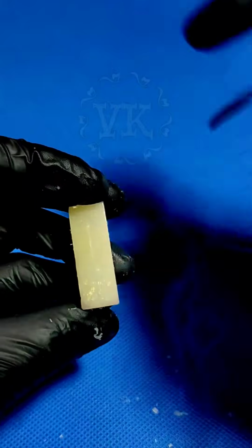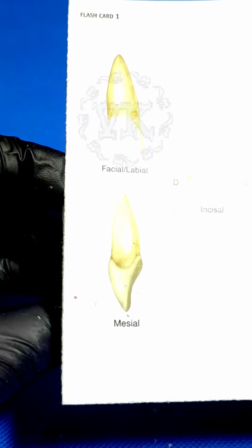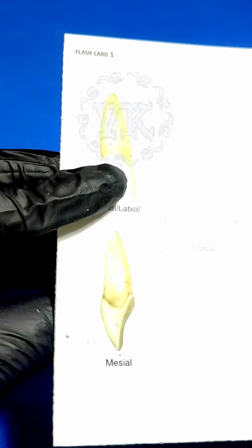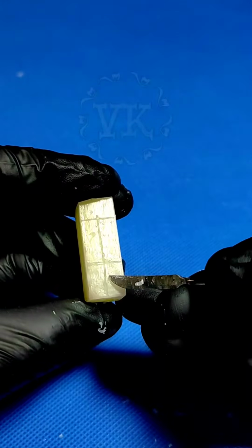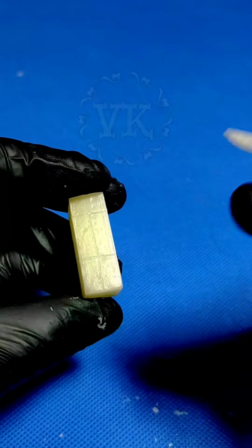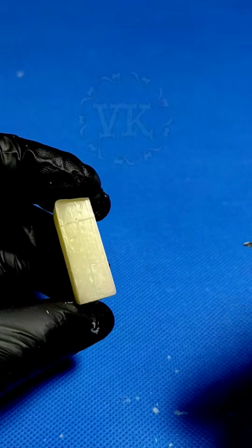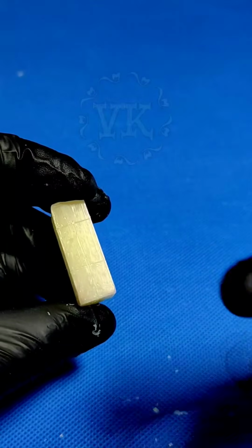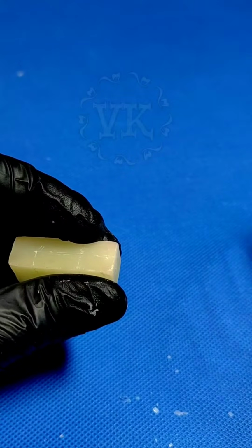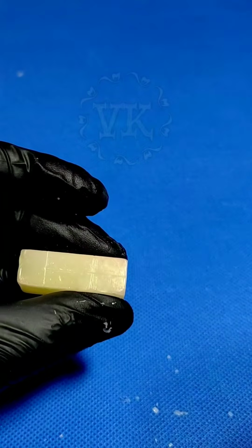And then as we discussed, I'm going to draw this view. The maximum thickness from this point to this point is 7 millimeters. So when I bisect 7 millimeters, it will be 3.5 on this side and 3.5 on this side. 3.5 is something difficult to measure from the ruler on the wax block, so we would take 4 millimeters and 4 millimeters. So effectively it becomes 8 millimeters. This is also in accordance with the previous technique, so all the measurements are taken half a millimeter to 1 millimeter extra.